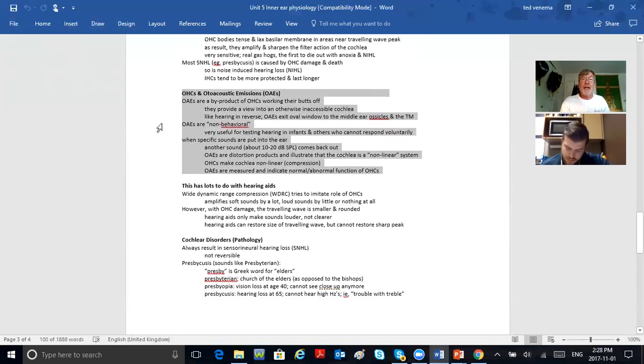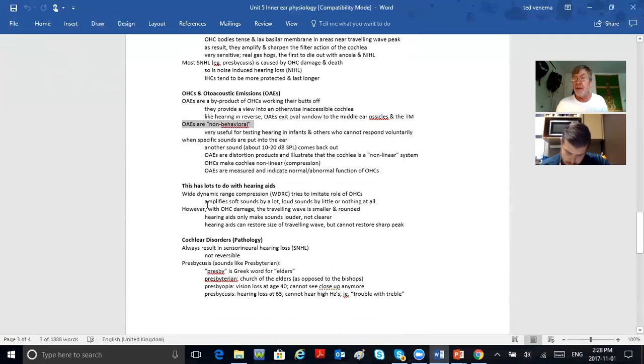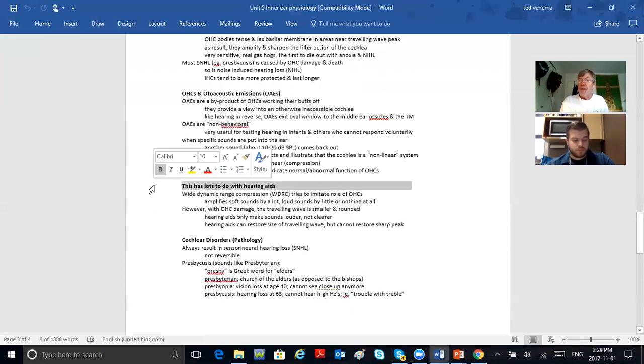Oh, by the way, non-behavioral is a good word to know. Non-behavioral means you didn't voluntarily make a response. It just happened in your ear. You had no choice. You're not raising a hand. If you're raising a hand when you hear a tone, that's called a behavioral test. If you're answering back speech in a speech test, that's behavioral because you're voluntarily answering back. Otoacoustic emissions either happen or they don't happen, but you don't have any control over it. Non-behavioral, okay?